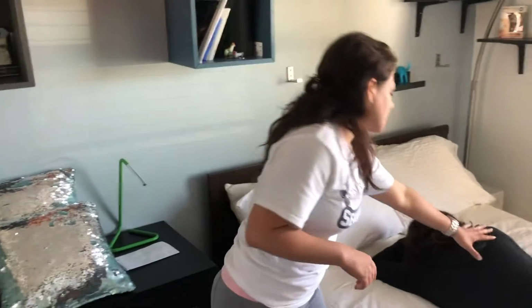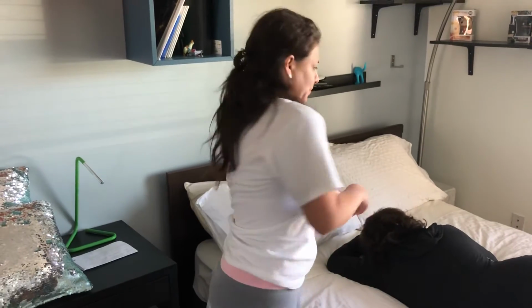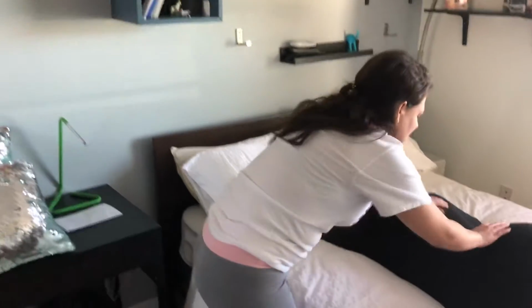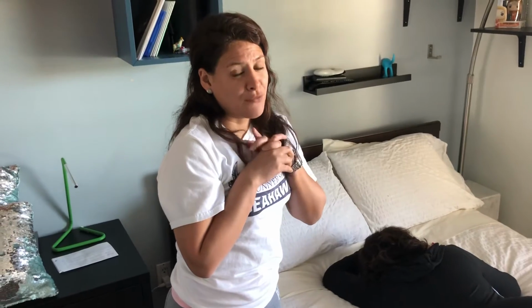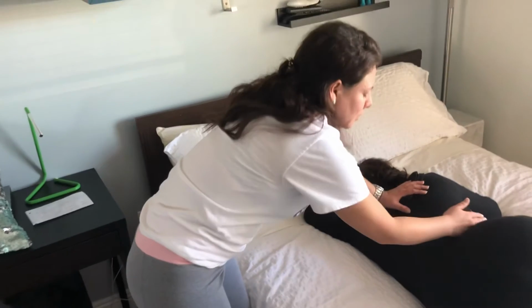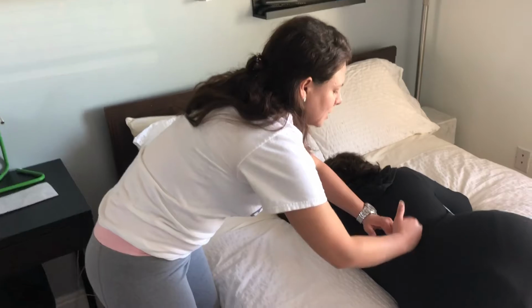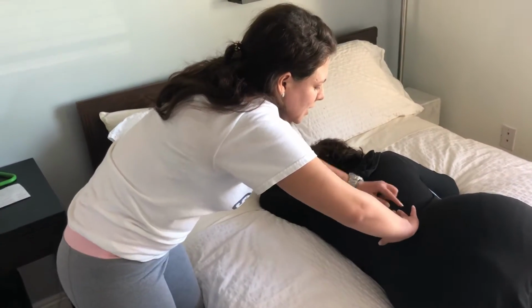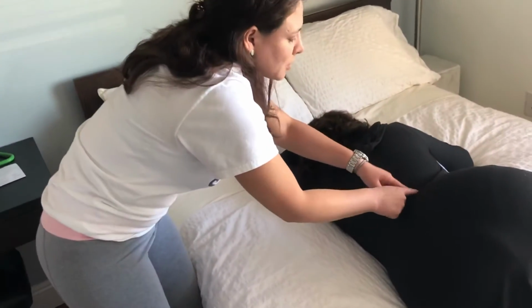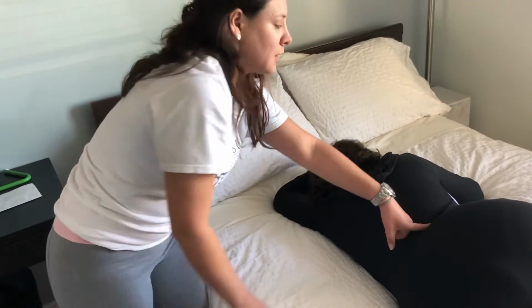The other position we can do is the LAO, and the rotation for both is gonna be the same. Either LAO or RAO needs a 35 to 45 degree obliquity. The center ray is at the iliac crest, the same for all, and it's gonna be 1 inch lateral. So 1 inch will be here from my sagittal plane, and I will put my central ray over here. That is for the LAO.